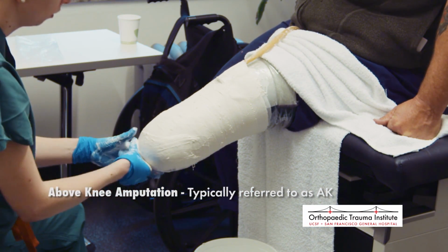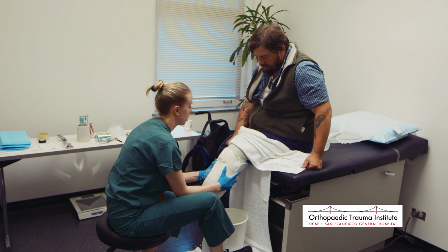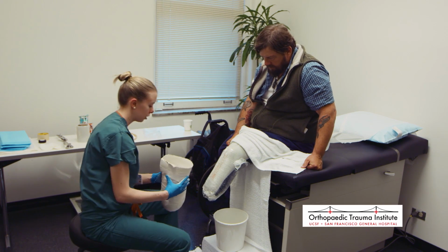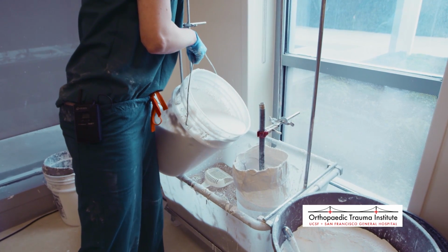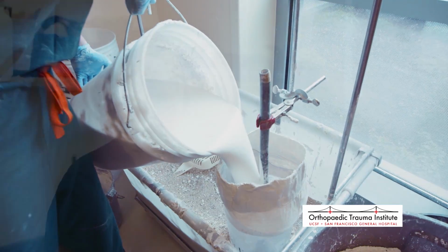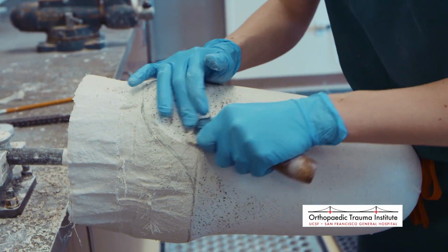And that is going to be very customized, again, based on where we can place pressure, where we can't. We're never trying to put pressure on the bottom or weight-bearing area of a cut bone. So we always try to make that comfortable. But in order to do that, we have to copy the shape of the leg or arm. And then once we have the cast, we fill it with plaster so that we get a positive model. And that positive model is the exact copy of your leg at the time that we cast, but sometimes we'll change it a little bit to increase or reduce pressure in certain areas, and that's the modification process.